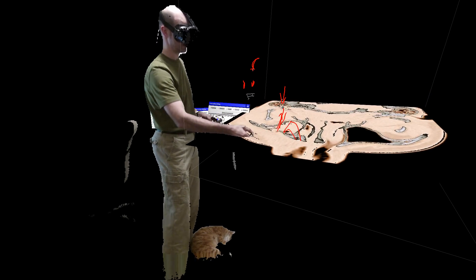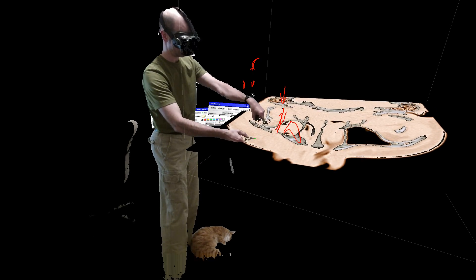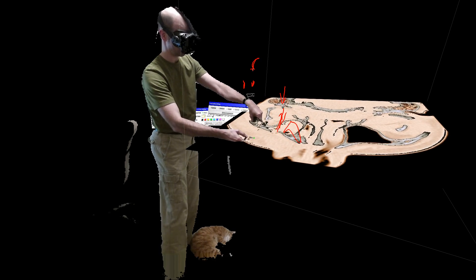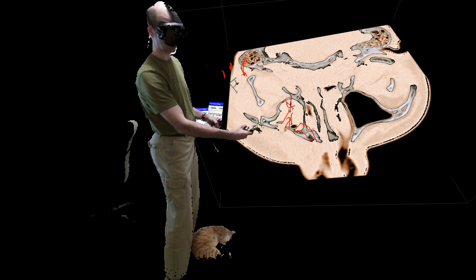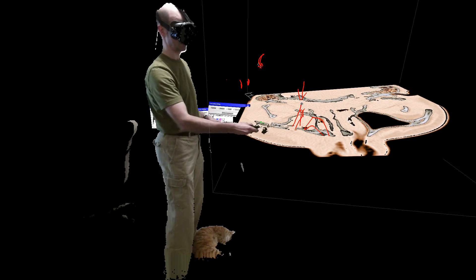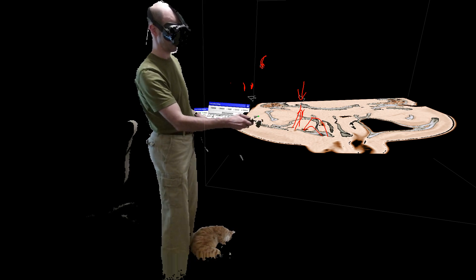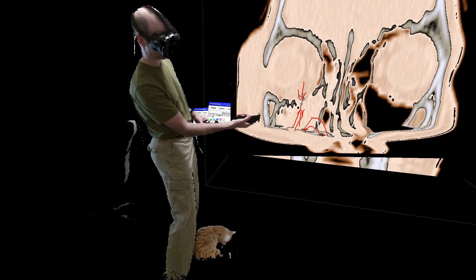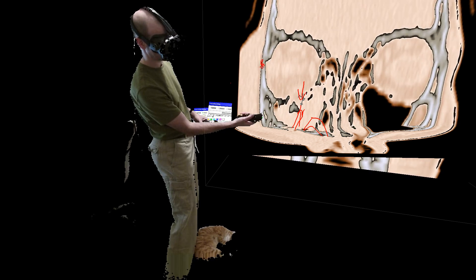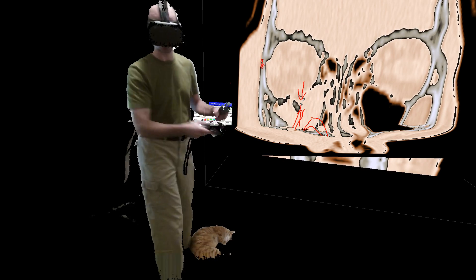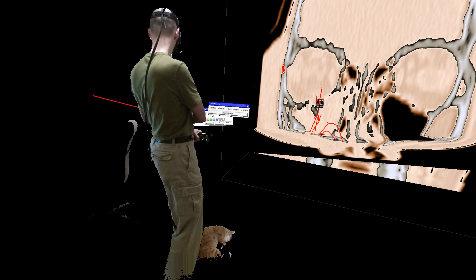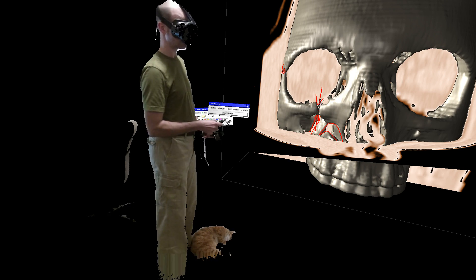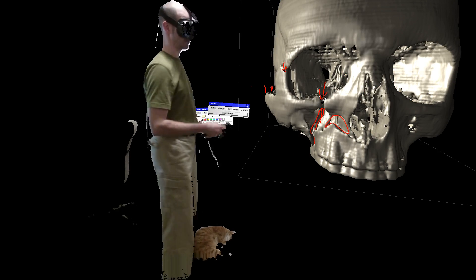And so if you drag a slice through, which is more or less a traditional way of how you would look at these kind of data, you can see what is going on. You can see that there's a fracture right here because there's a displacement between those two bones. But it's just a 2D cross section. So you can't really tell what the three-dimensional shape around that is unless you're really well-trained in that. I can, of course, make another cross section like this at an angle, which might help a little bit. But still, we're only looking at 2D planes.